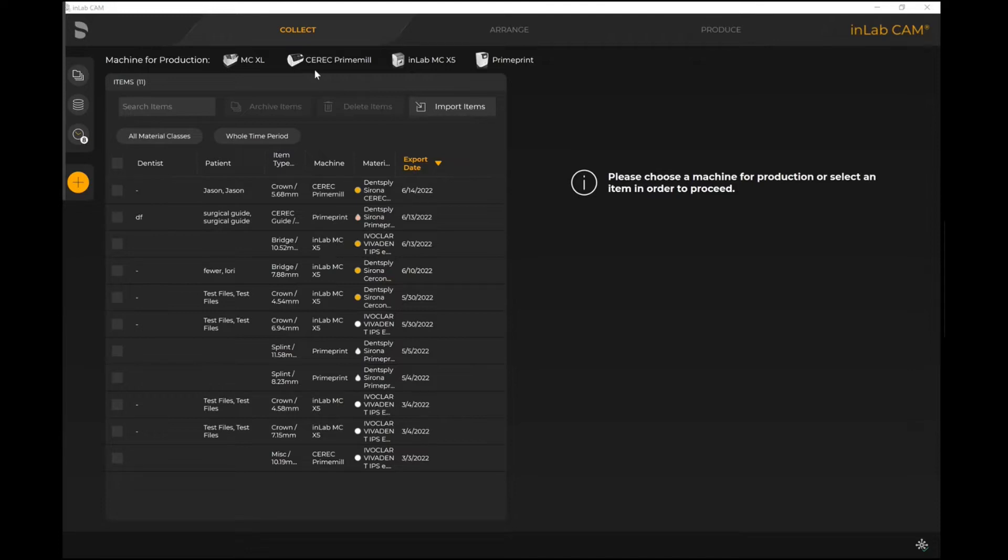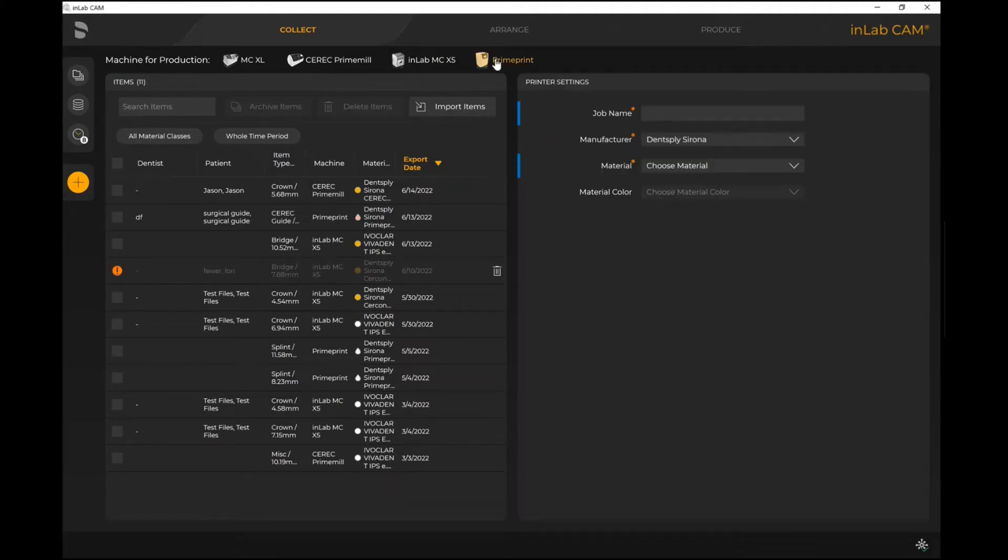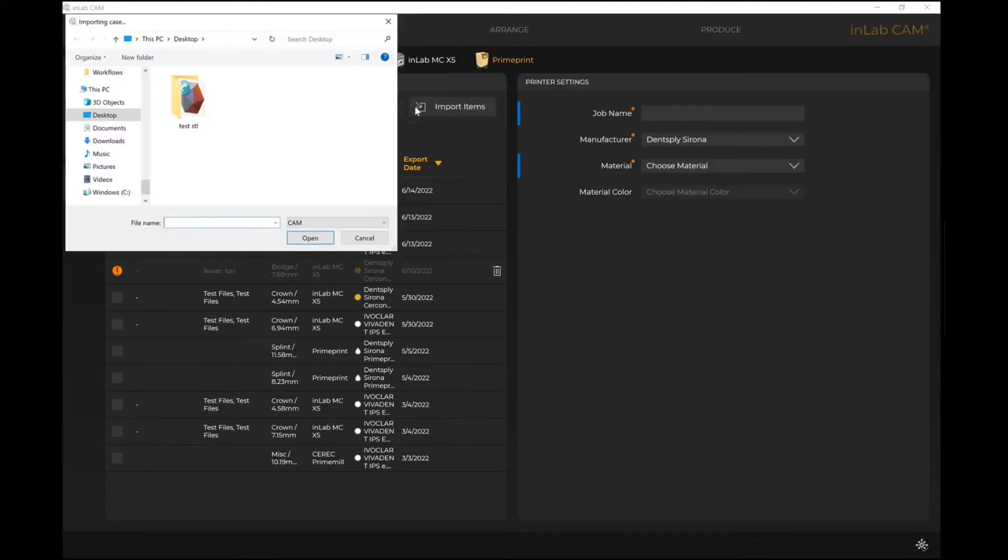For example, the Prime Print or even the Cerec Prime Mill now show up in inLab 22 CAM. Just below, there's also the item where you can import items. So let's say for example with Prime Print, I plan to import an item.